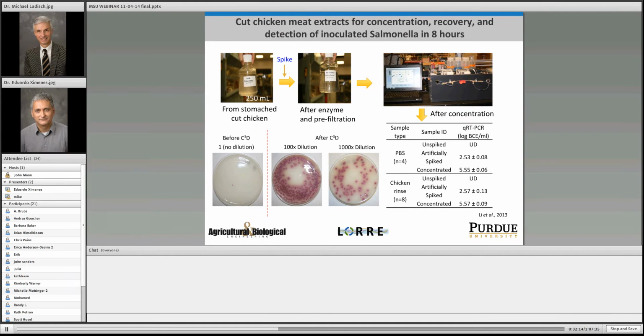So in the bottom of this slide, you can see, again, one observation here is that in this case we use C3d, one version before our latest version. You can see some pictures showing microorganisms on selective medium. And in this case, as selective medium, we use the chroma agar for salmonella.